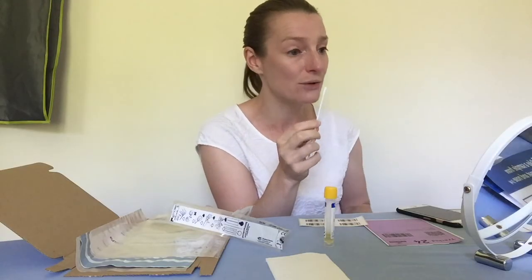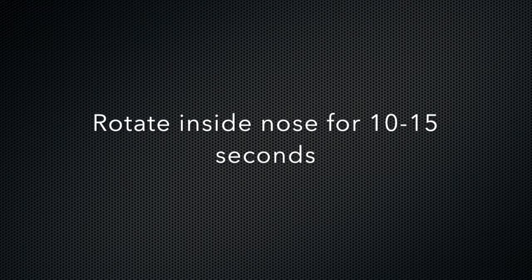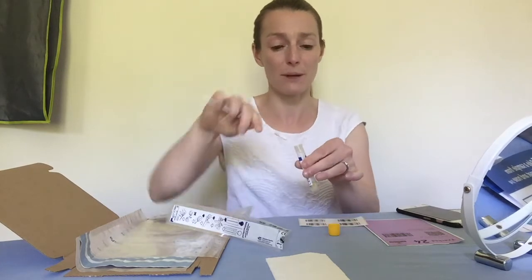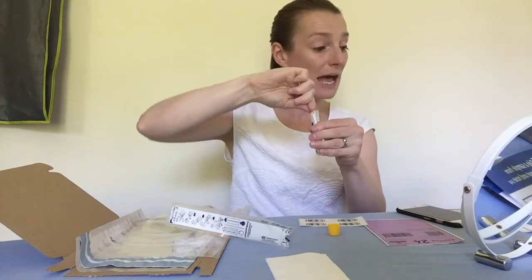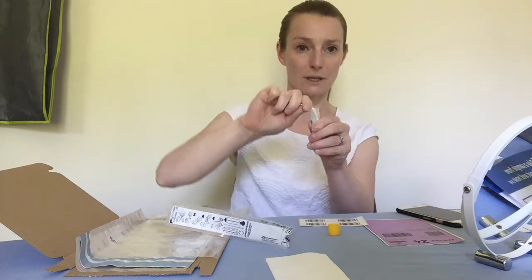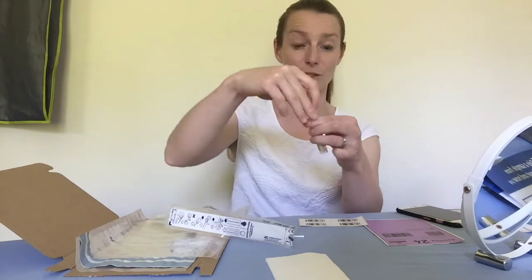Then I'm going to put it inside my nose. Then I'm going to pop it into the tube and snap off the top. There we go — it's snapped off. And then I'm going to put the lid on.